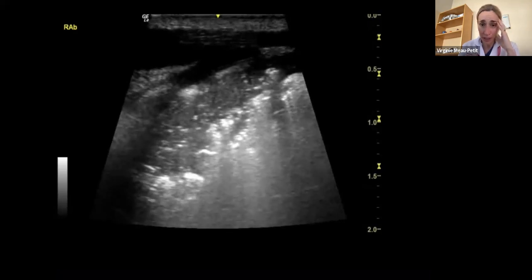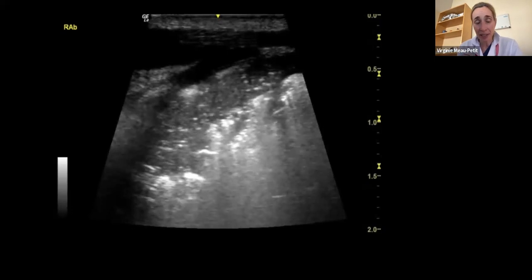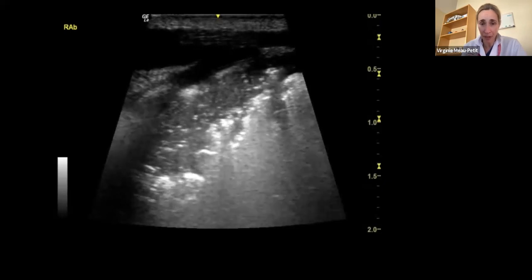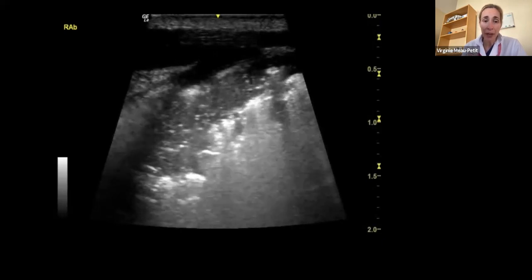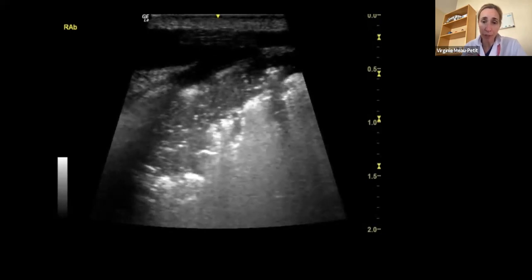And then I retrospectively looked at a patient I used to scan, because I actually did exactly the same previously when the patient was very unwell. The nurse called me, this patient is increasing the need for oxygen, the gas is not good, I've checked everything clinically. When you find this big consolidation in a chronic lung disease baby, you just want to open up.